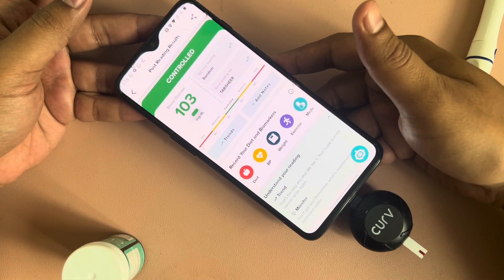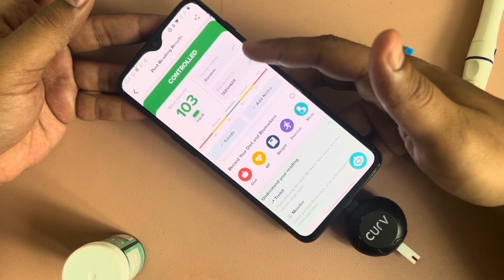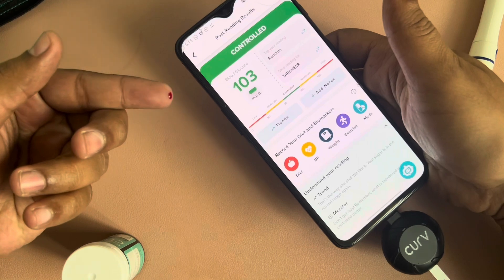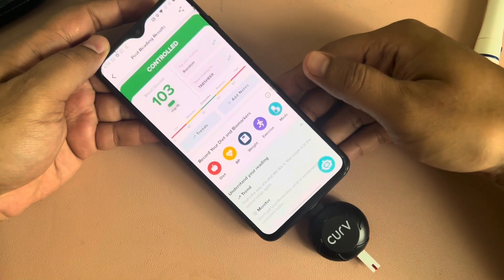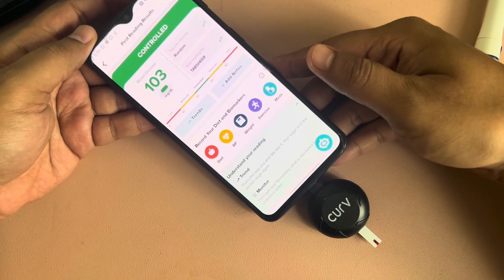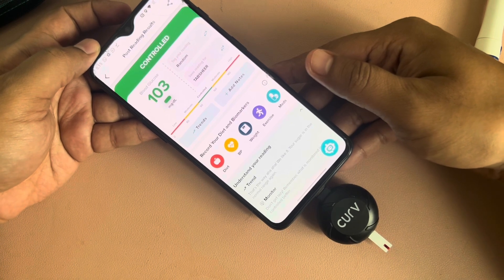So that's how you do a quick blood glucose level test. You can save results against different people — as of now I have saved against my name. Take a little cotton and clean the blood off your hand. That's how you do it. Hope this was useful, let me know in the comments if you have any doubts. I'm not a professional, I'm not a doctor, so please don't judge based on that. This is how I do it — let me know your thoughts.